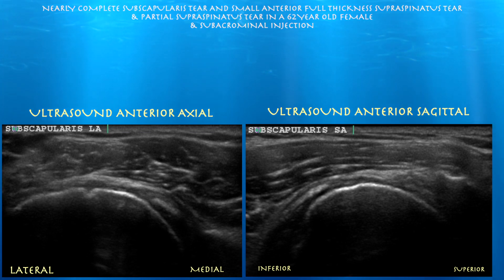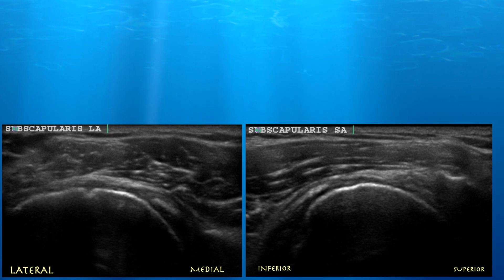I'm curious to see what this looks like on ultrasound. Her MRI was done about five months ago, so we'll see if there has been progression. The MRI also showed a high-grade articular-sided supraspinatus tear.